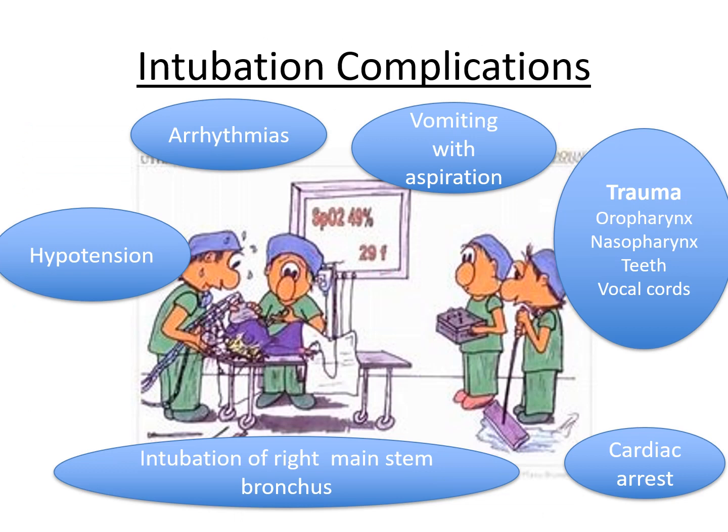Unfortunately, with any intubation, there's always potential for complications. Vomiting with aspiration is one of those complications. Intubation of the right main stem bronchus is another. In that case, your left lung would not be adequately ventilated and can become atelectatic. That's why it's very important to listen to bilateral breath sounds and note the position of the tube, so that if it does happen to migrate down, it's usually going to migrate down into the right main stem bronchus.